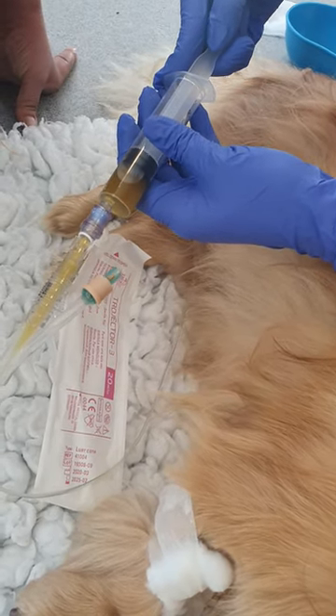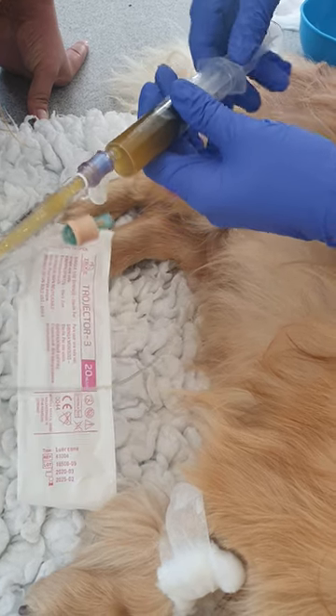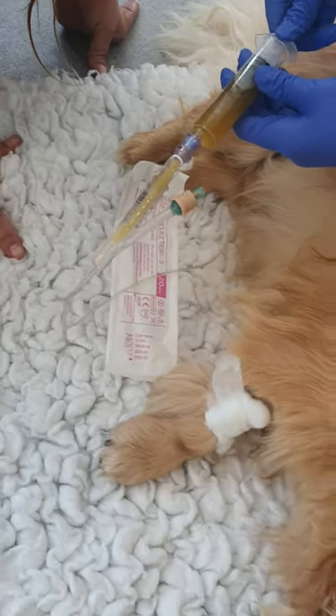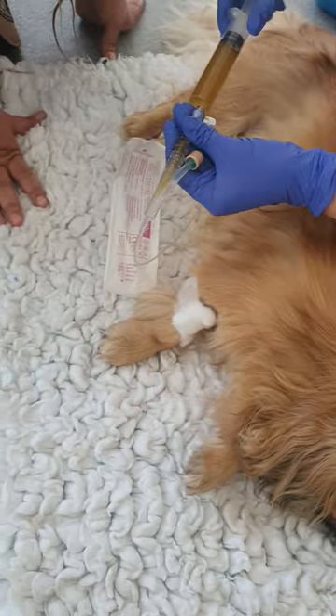It shouldn't be too much pressure. Just nice and slowly, just a little bit. I'll do this syringe and then if you do the next one. Then once you've finished, just twist it.